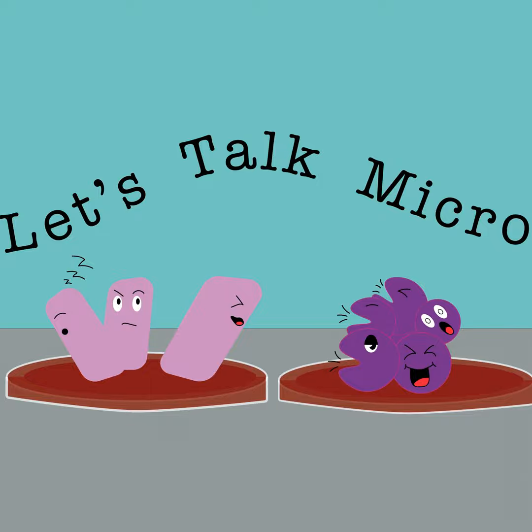I keep saying this test, even though maybe if you're a tech in the US, you might not use it, but it's definitely good to know about it. You will be tested about it when you take your licensing boards, like the American Society for Clinical Pathology, ASCP. And if you're a listener from another part of the world, then you know that you use it in your lab. So it's great to correlate all this information. It's a very important test used to differentiate Enterobacterales from other gram-negative rods.